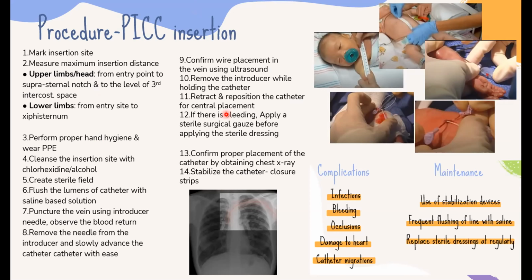So again, where should the tip of the PICC lie? In the superior vena cava or inferior vena cava? Proper placement.